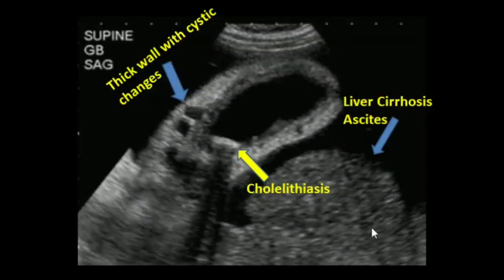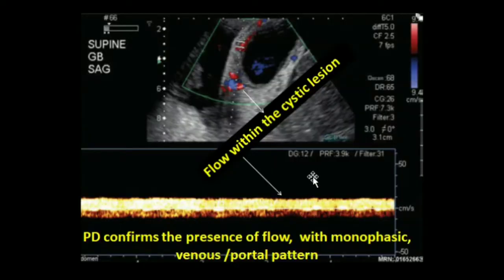This image belongs to a male patient of 50 years age suffering from liver cirrhosis. In this image we can appreciate an irregular outlined liver, ascites, thick-walled gallbladder with multiple cystic lesions in the wall, and gallstones are also appreciable. By applying color Doppler, the cystic lesions in the wall of the gallbladder were appreciated.